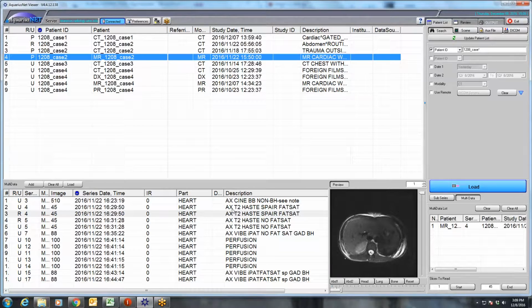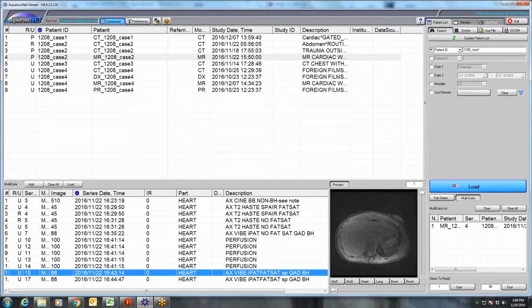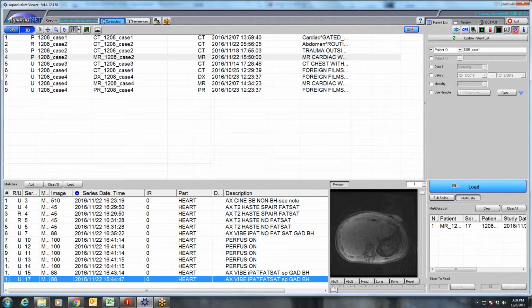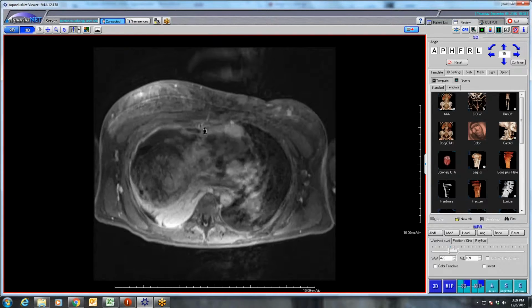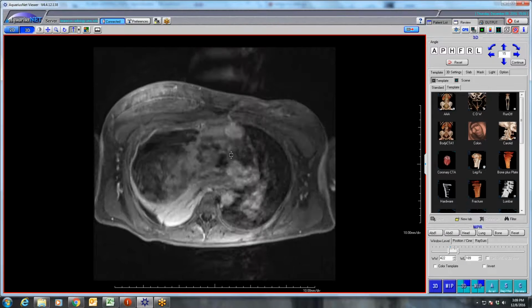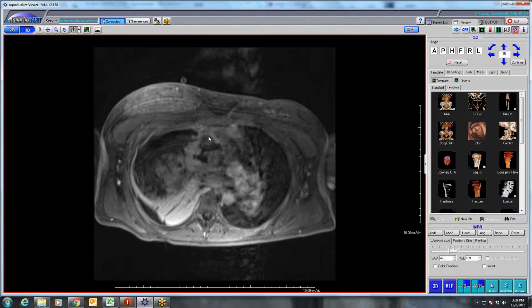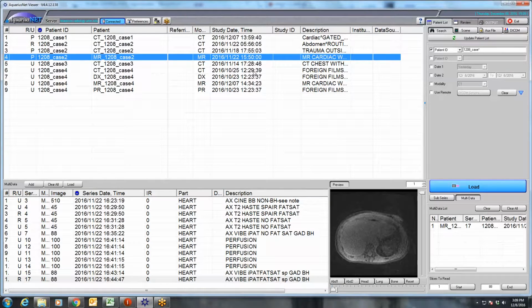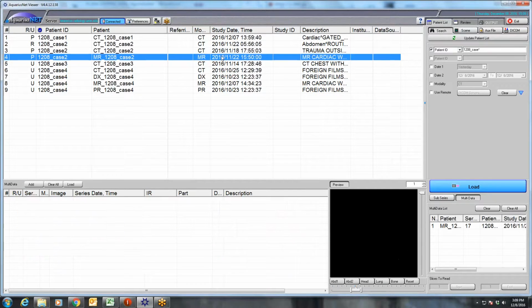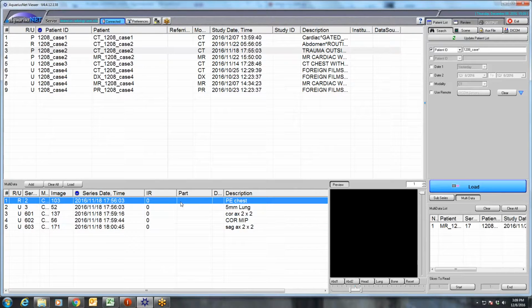And that corresponded to a focus of hemorrhage on the T1 weighted imaging. So long story short, complex lesion, this was taken out. And even though there's really, here's a vibe, about a minute post-contrast, you can see how complex this thing is with these areas of enhancement. Anyways, this turned out to be a myxoid liposarcoma.